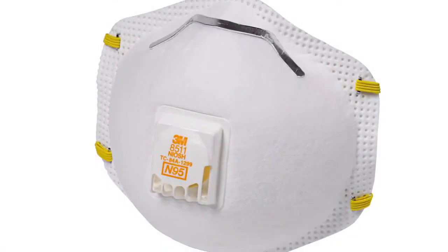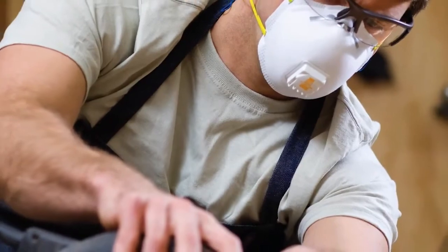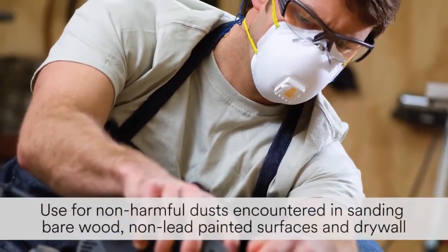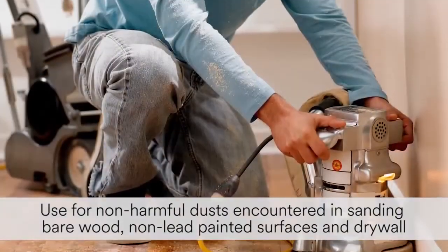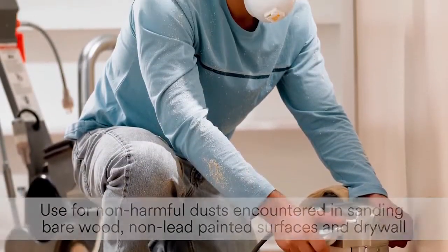The 8511 is a NIOSH approved N95 disposable particulate respirator. You can use this respirator for non-harmful dust and certain particles encountered during sanding projects, such as bare wood, non-lead painted surfaces, or drywall.